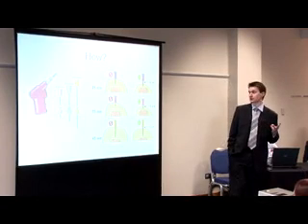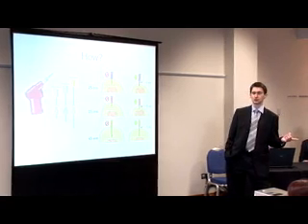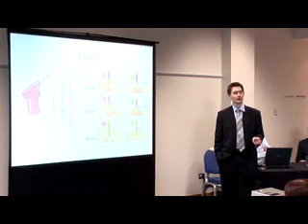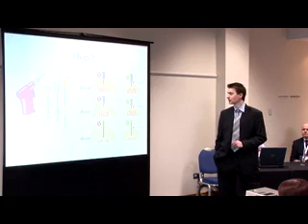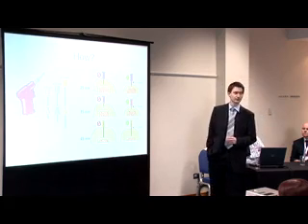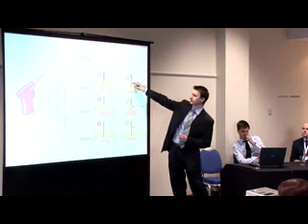So you've got 3 needles to choose from. The first one is a pediatric needle, okay? So it's a pink needle, it's the shortest one, it's obvious, that's what you're going to use. The second one and third one are both for adults, and it partly depends on the size of your patient and where you're going to do it, and the amount of soft tissue that you've got. So there are depth markers, which they don't project up too well on this slide, but there's black lines every 5 millimeters up it.